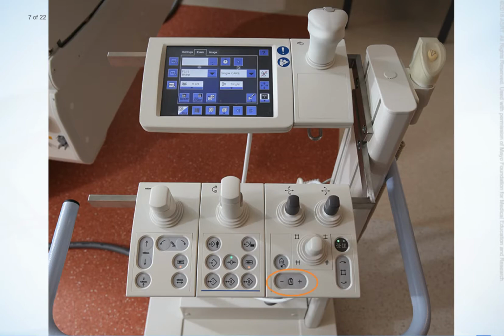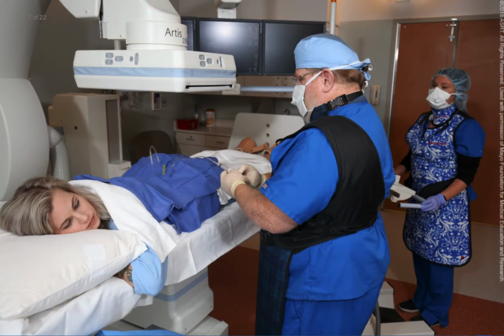The use of magnification increases spatial resolution, but also increases the radiation dose to the patient, and should be used sparingly during the procedure. The total time the beam is on should be limited as much as possible by using intermittent fluoroscopy, LIH, and pulsed fluoroscopy. All personnel and family in the examination room are required to wear radiation safety equipment, including lead aprons and thyroid shields. If the fluoroscope being used has a lead protective curtain, it should be removed so it will not interfere with the integrity of the sterile field.